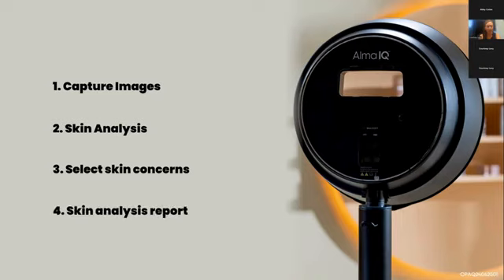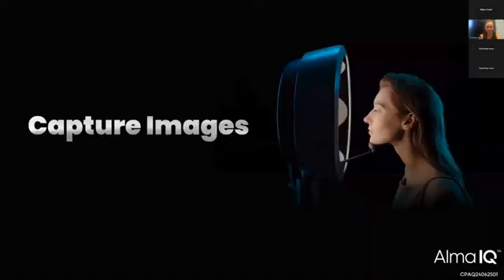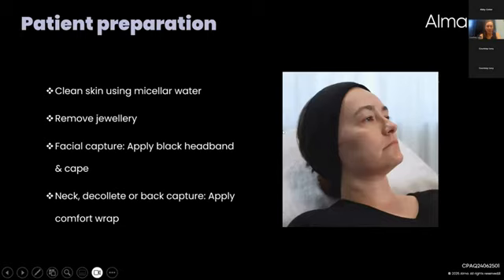And finally, we have the report, which is a very comprehensive report which can be sent to the patient with pricing, with a full comprehensive treatment plan. So once we get to this part, we're going to switch onto the iPad and go through the report on the iPad as you would in clinic. So starting by capturing our images.